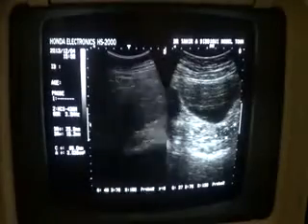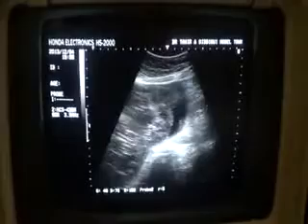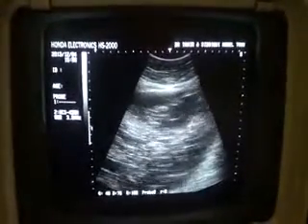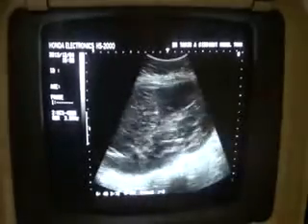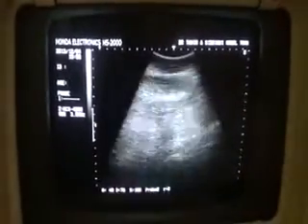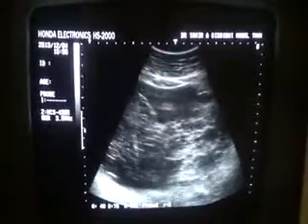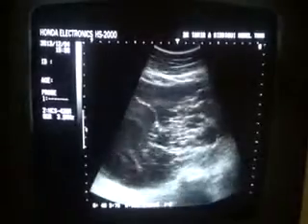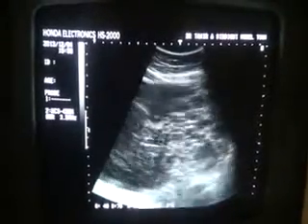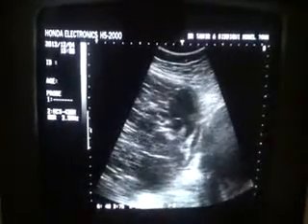Now you see this encapsulated cyst with numerous internal septa communicating with each other, and with abundant fluid component echoes within.